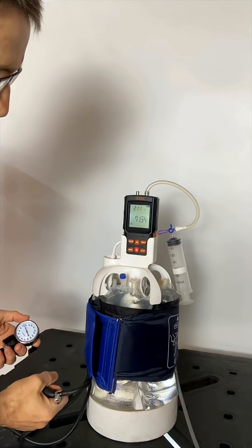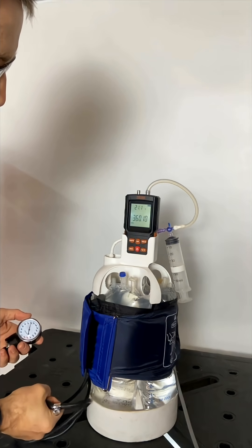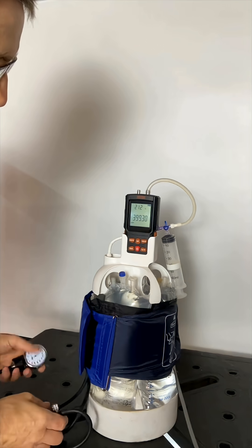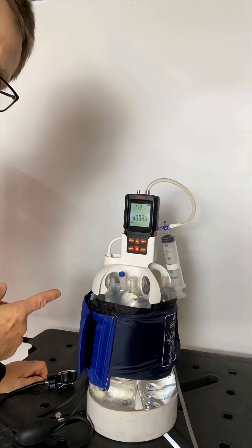This is in millimeters of mercury. As always, pressure decrement happens under every tourniquet — you've got to keep that in mind — but that's up to 400.